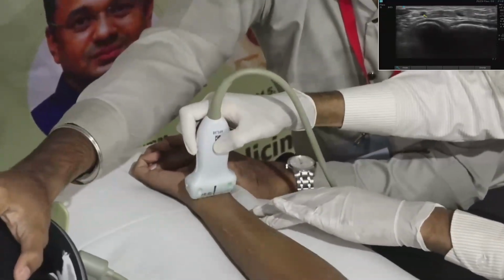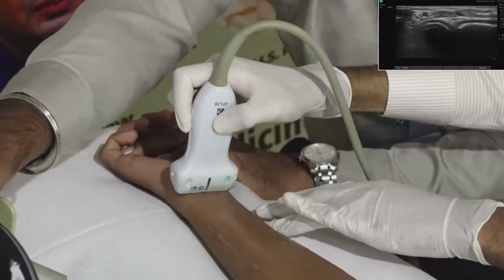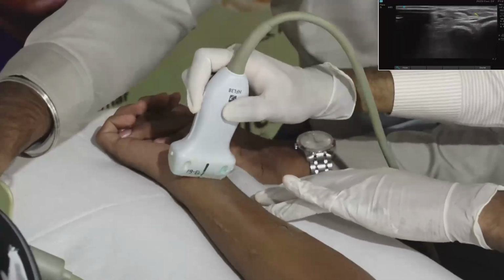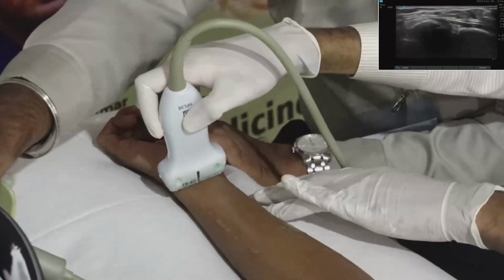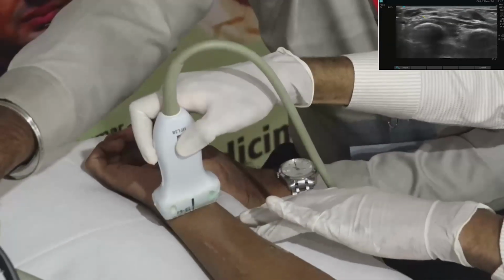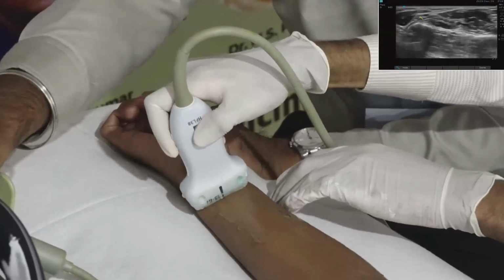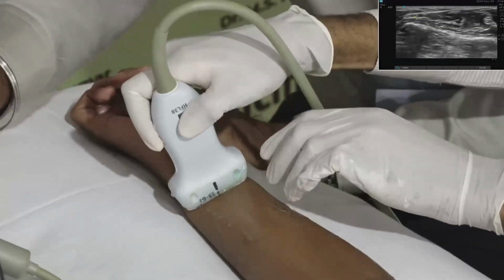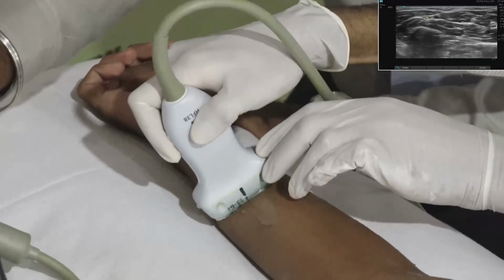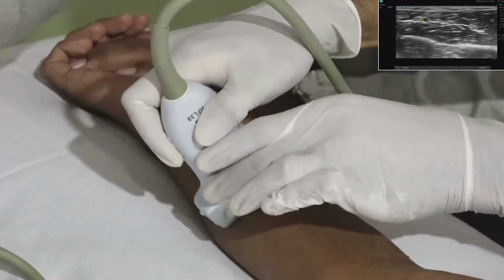Here we don't see individual nerves very clearly. You see more of tendons only. Everywhere we see a lot of tendons. We don't see any muscles here. But if you go to the ulnar artery and trace it proximally, the nerve component, hypoechoic honeycomb appearance, which is just traveling next to the ulnar artery, that is ulnar nerve.